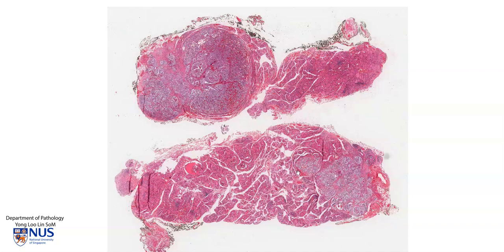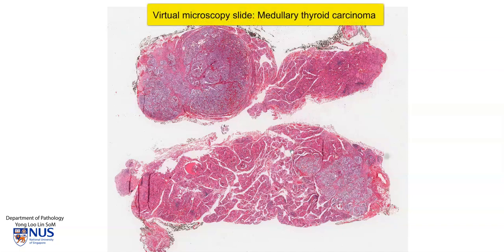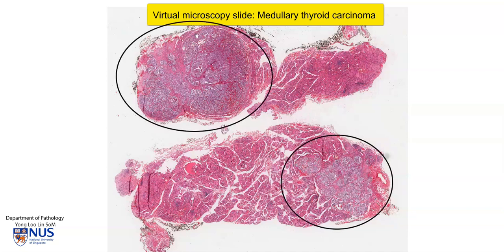Hello, this is a virtual microscopy slide of a thyroid gland showing the presence of a tumor. We can see two slices here and the region of the tumor is here as I am outlining, and on this slice it is here.